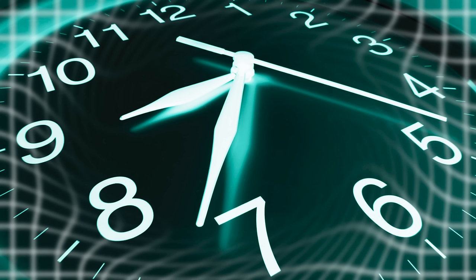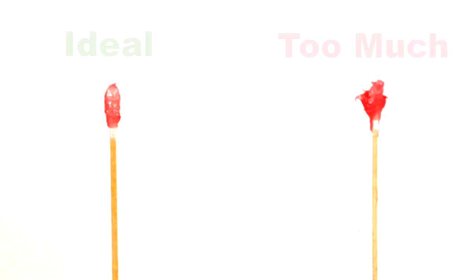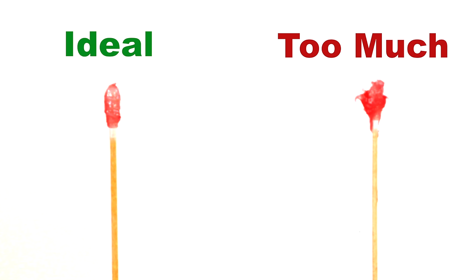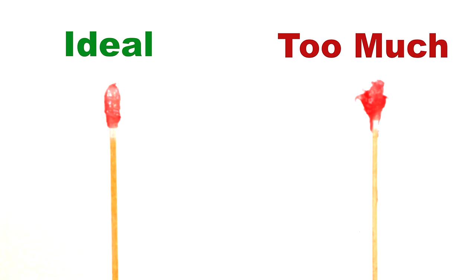This should only be done for the short period of time that it takes to deliver the initial injection. Next, place the topical and allow the topical anesthetic to sit on the tissue for 60 to 90 seconds. If the injection is not initiated within 90 seconds, reapply the topical anesthetic. By ensuring that your assistant is loading the cotton tip applicator with the appropriate amount of topical, you can avoid the need to clear any excess.